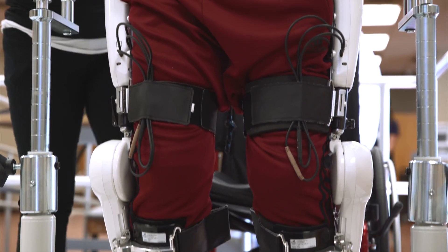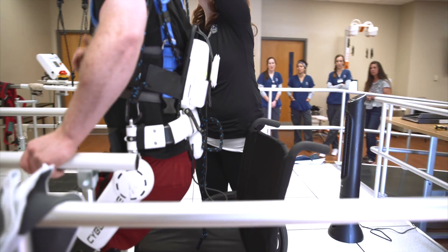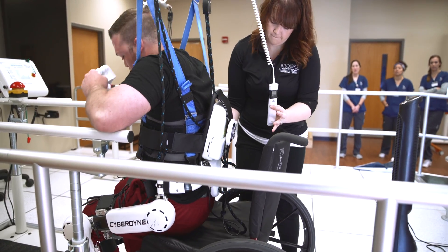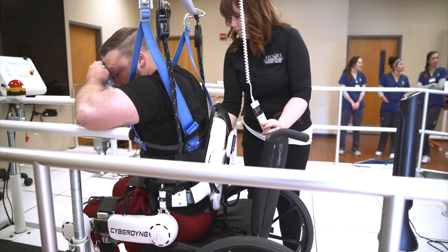Three years ago, Dr. Paris, Dr. Tunuzzi, myself, and Michael Spiegel were lucky enough to take a trip to Germany to see the only operational facility in the world. We were able to speak with their physicians, see their facilities and operations, and we were wowed by the entire experience. We wanted to pursue Brooks being the first to introduce Cyberdyne to the United States. Fast forward three years — in December 2017, Cyberdyne received its FDA clearance for HAL for spinal cord injured patients, and hence started our Brooks Cybernic Treatment Center.